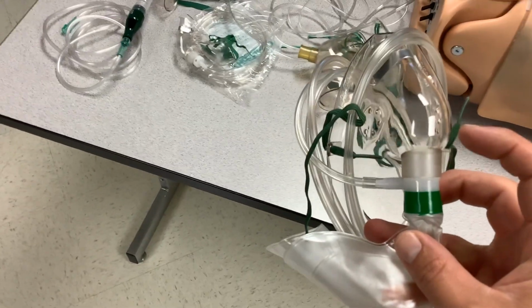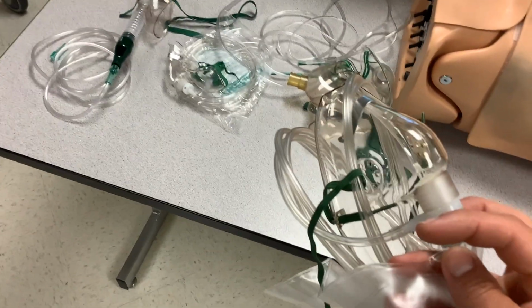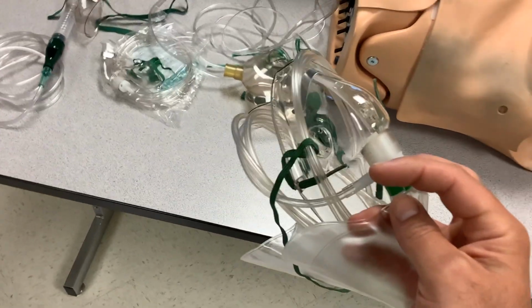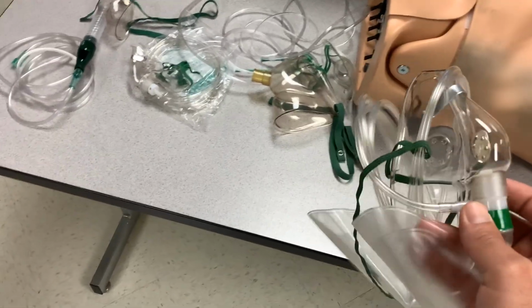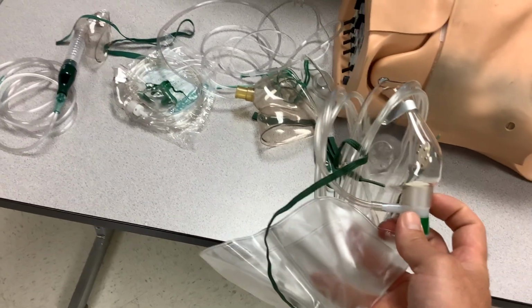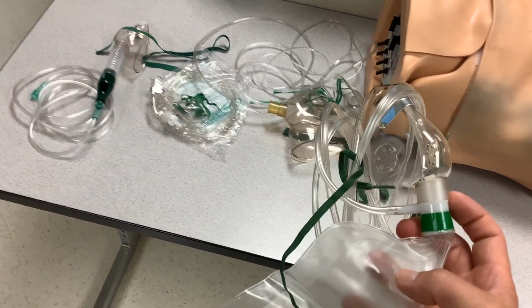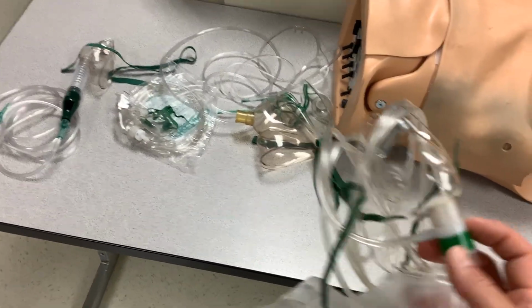The oxygen tubing gets attached to an oxygen flow meter, and you're going to run that between 10 and 15 liters per minute. I typically tend to tell everyone just to go ahead and turn the flow meter open as wide as it'll go, because ultimately you want as much oxygen going into this reservoir bag as you can. If the patient's wearing the mask and they're causing this bag to collapse as they breathe in, you need to increase the input flow through the oxygen tubing.